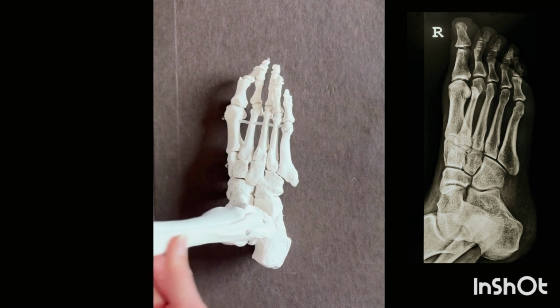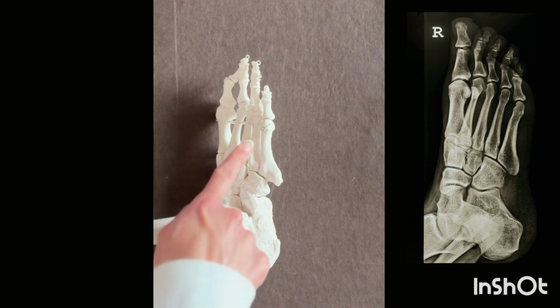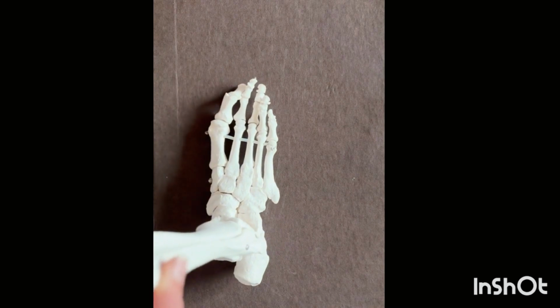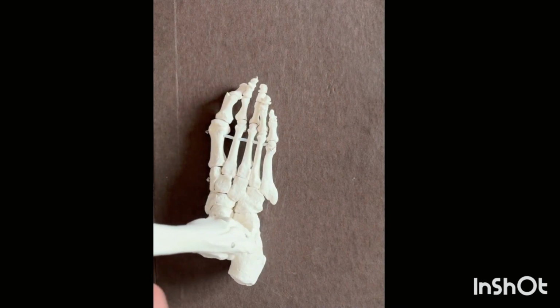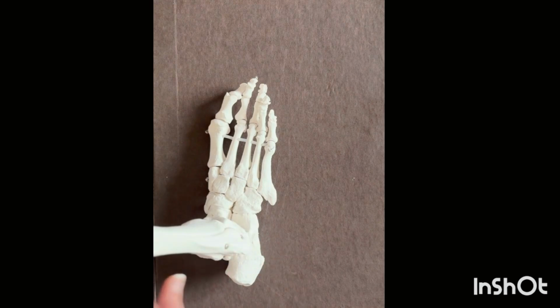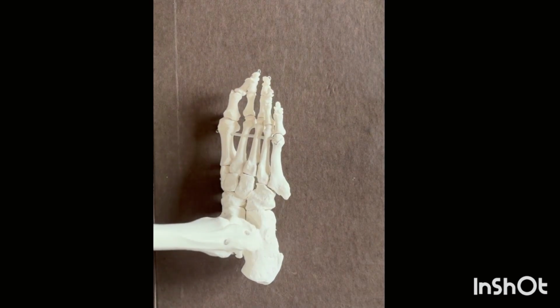If you rotate the patient too much, you'll end up seeing the metatarsals more superimposed. If you do not rotate the foot up enough, then you'll still see superimposition here between the third, fourth, and possibly the fifth metatarsals. You really need to rotate their leg up more than you think.